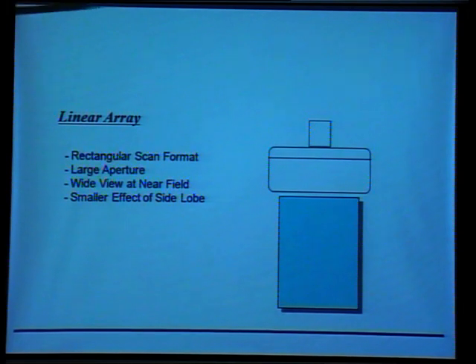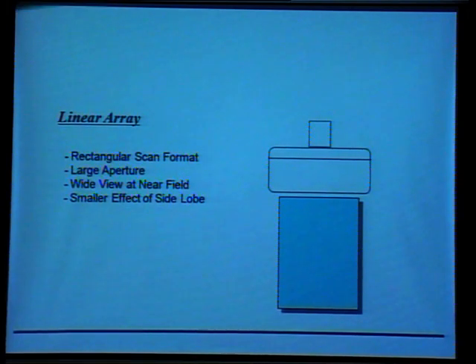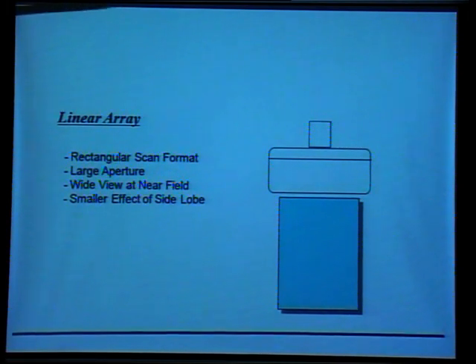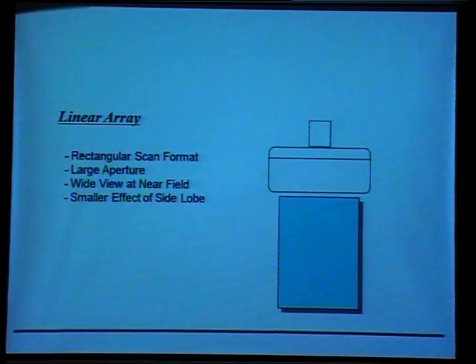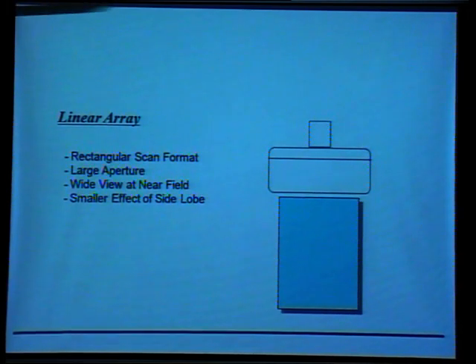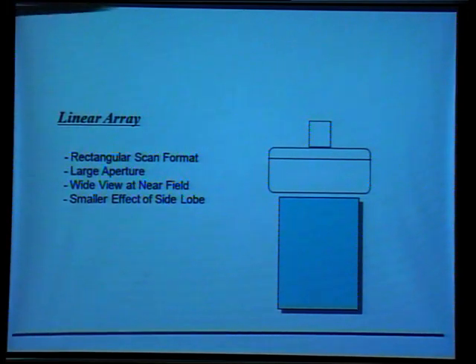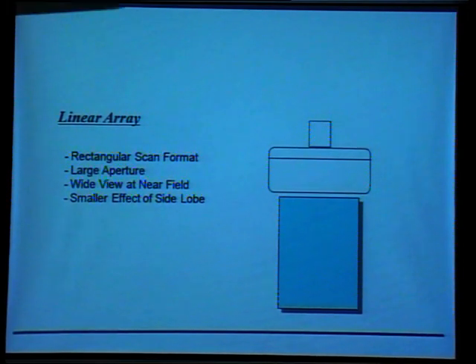Patients, it could go slightly more high, maybe 9 megahertz. The second commonly used array of transducers is linear, which is used for peripheral vascular applications. Peripheral, as the English word tells me, peripheral. Periphery, outside, बाहर से जो दिखता है.